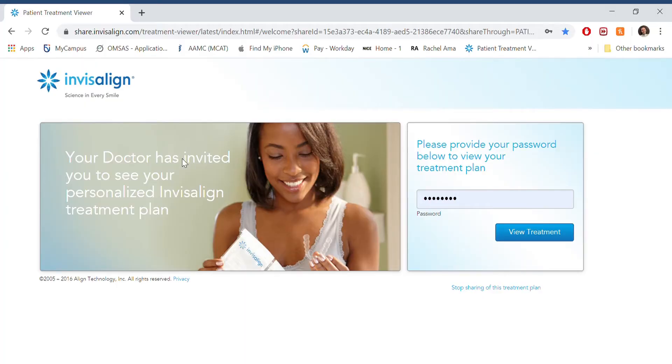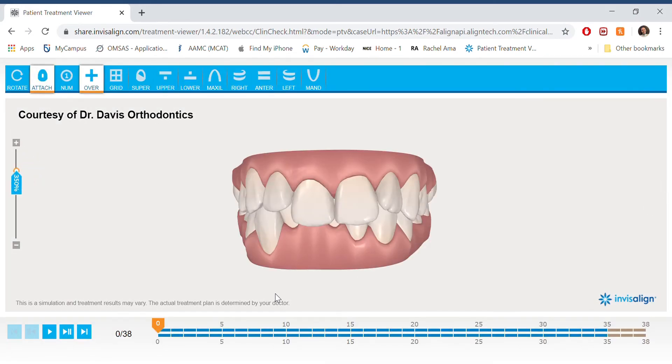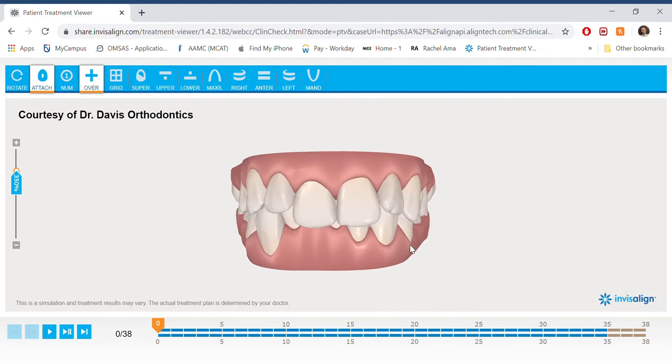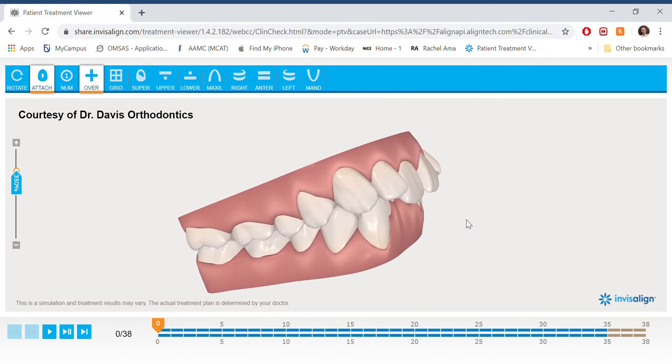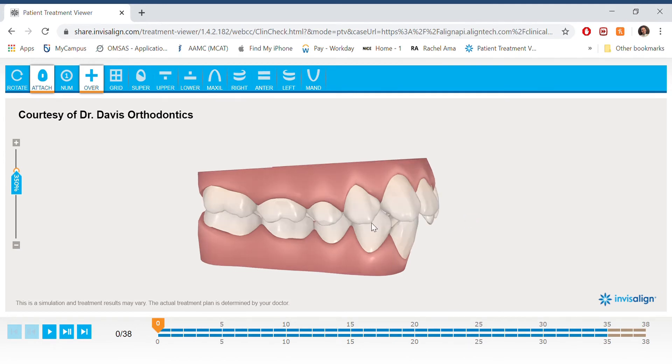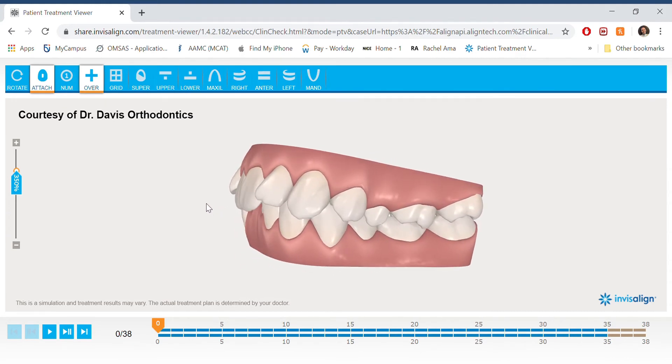Now here's what you've probably clicked on this video to see — my ClinCheck! I did a screen recording which I'm inserting here. My orthodontist sent me a link and an access code; when you enter that code into the ClinCheck website and click 'View Treatment,' it takes you to your personalized animation. Once you're in, you can see the 3D model of your teeth and rotate it any way you like to see different views. You can also use the bar on the left-hand side to zoom in and out, and along the top there are options to see the model from different angles.